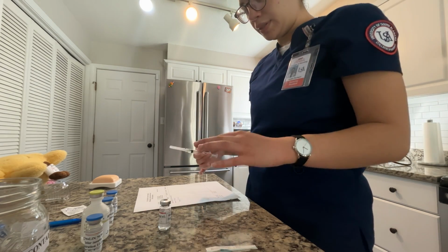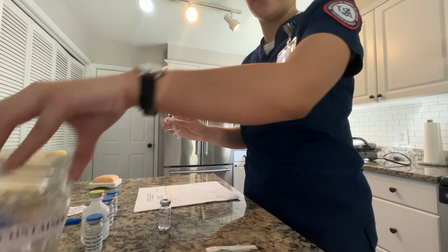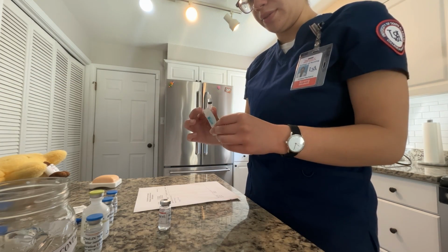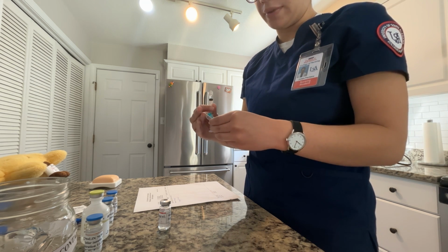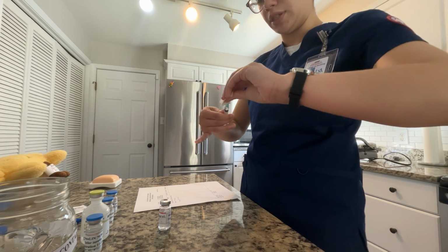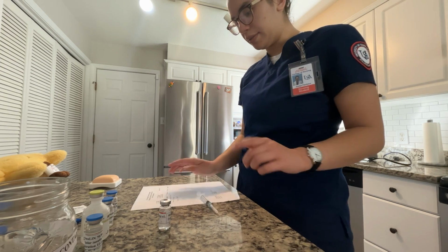Okay, so this is an IM syringe, so I'm going to get rid of this blunt cannula and dispose of it in my sharps container. Now I'm going to switch it up for my 23 by 1 inch precision needle. So I'm just going to leave this right here.